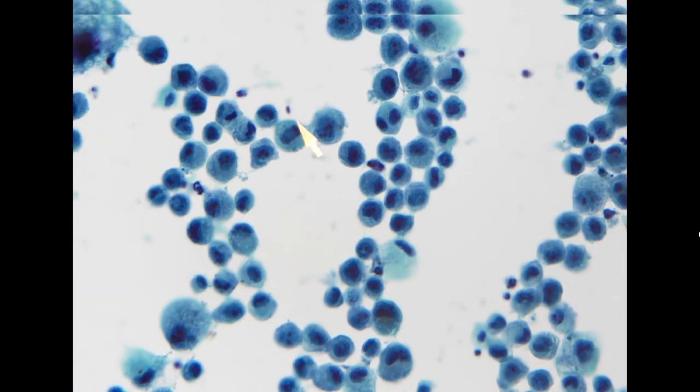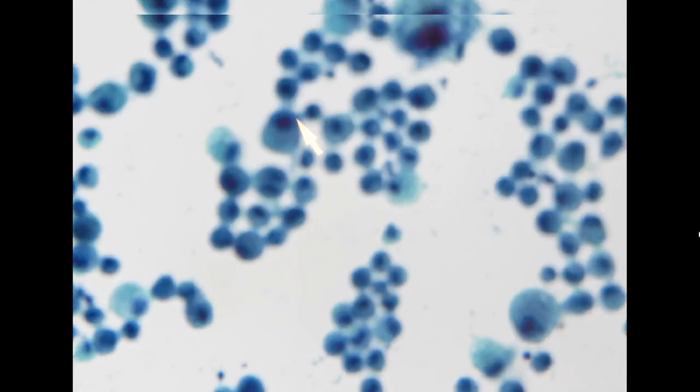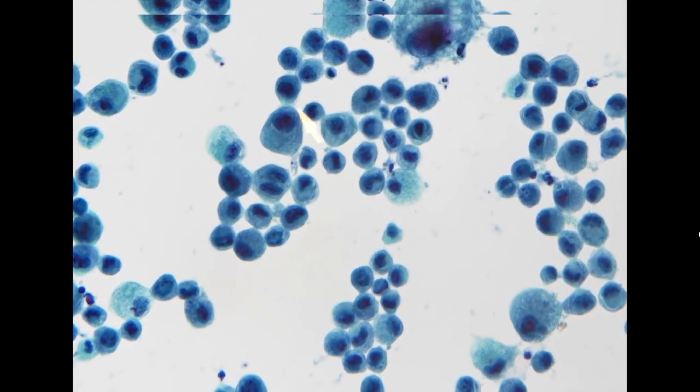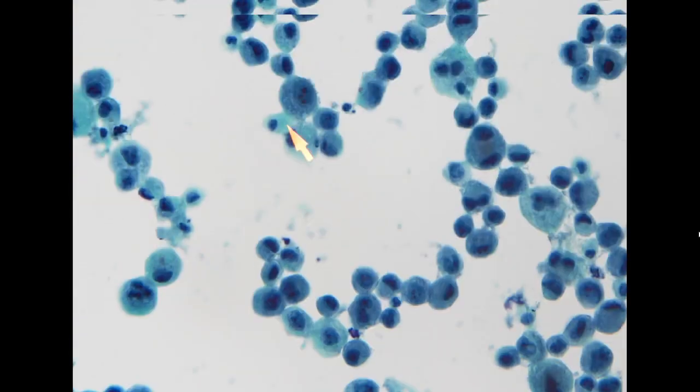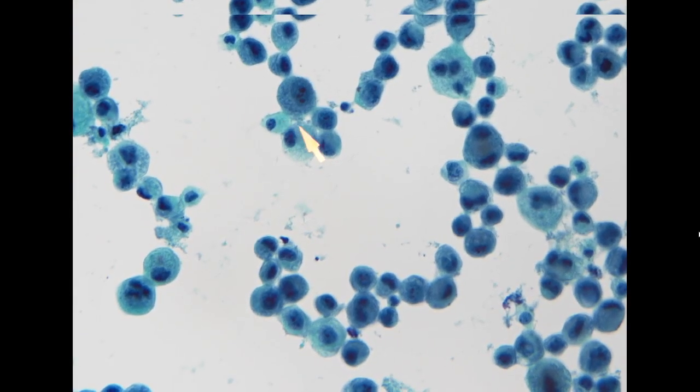Most of the cells have prominent nucleoli, and most of the cells have an eccentric nuclear location. This is a typical cytomorphologic feature for a poorly differentiated adenocarcinoma.